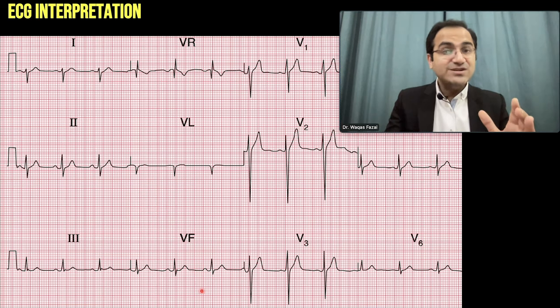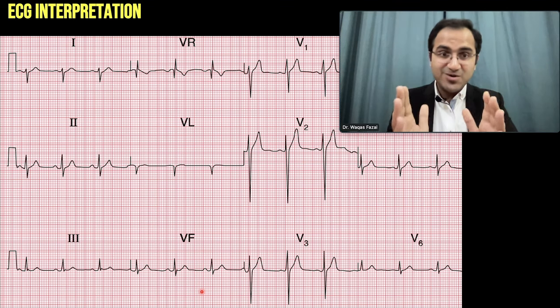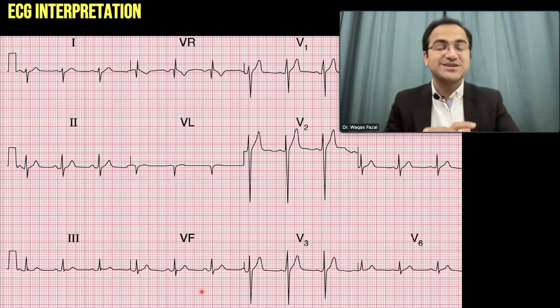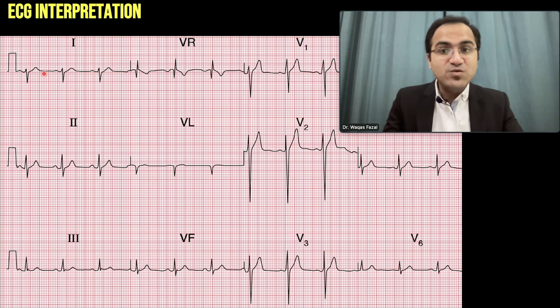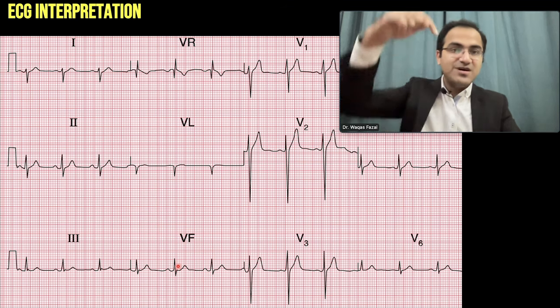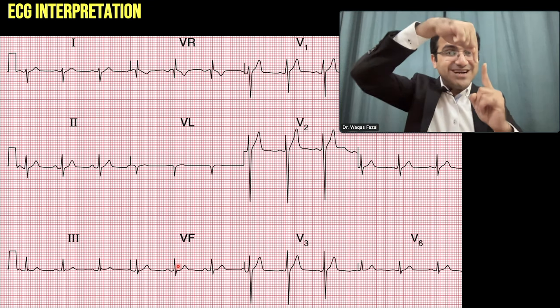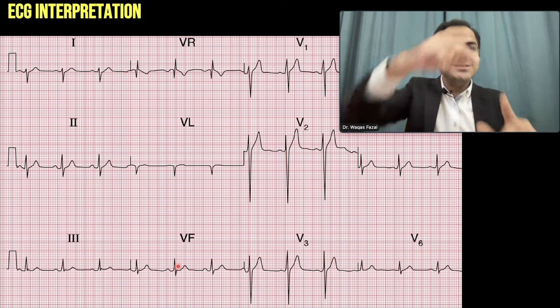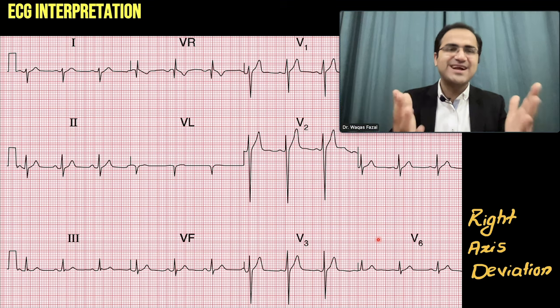Pause the video and solve the next ECG yourself — find out whether it is normal, left axis deviation, right axis deviation, or indeterminate. Coming to the answer: in Lead I, the R wave is negatively deflected — the R wave is downward. In Lead aVF, it is positively deflected. Lead I is downward, Lead aVF is pointing upward and they are reaching toward each other — 'Right Reaches' — so this is right axis deviation.